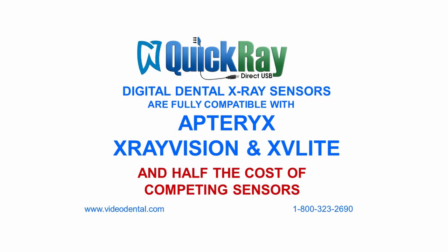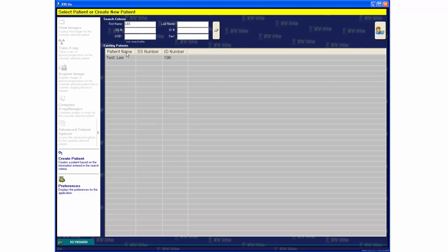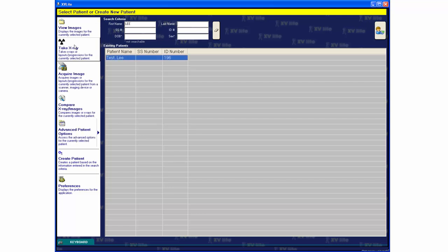Hi, this is Lee from Video Dental Concepts demonstrating QuickRay Dental X-Ray Sensors with Apteryx ExivLite Imaging Software.